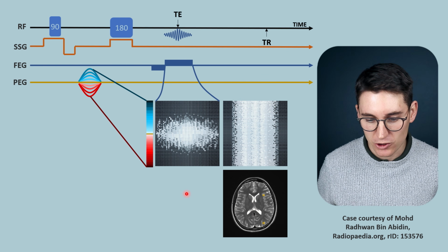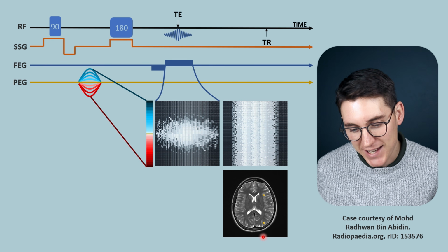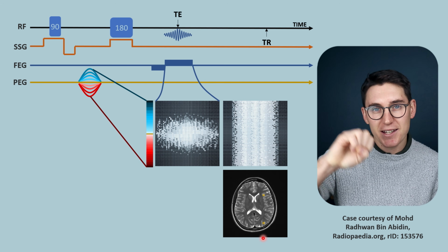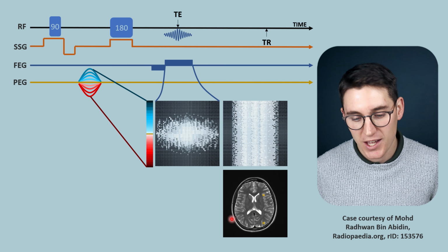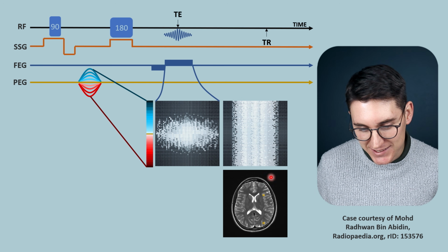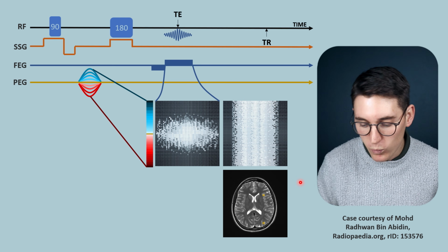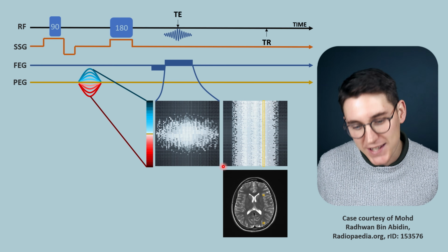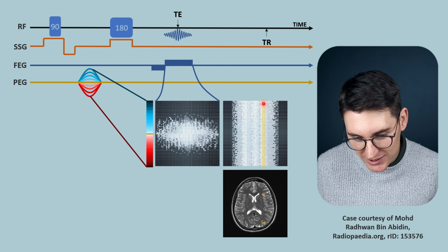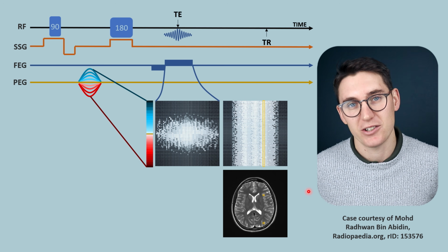So what we want to do is take 2 separate pixels here that have the same x-axis location and try and delineate the actual pixel values for these 2 locations. Now where exactly in this data set is the signal coming from in these 2 pixels? Well, we have organized the signal in this data set based on x-axis location. So the signals here will in part come from these 2 pixels that we are trying to calculate.